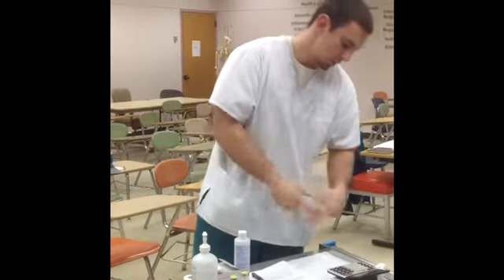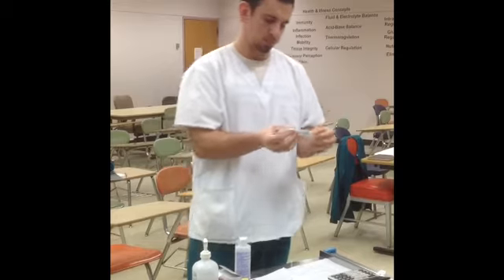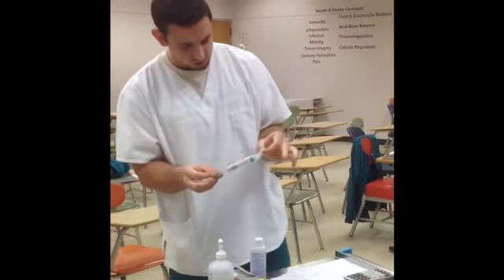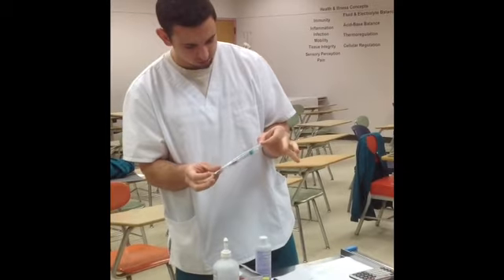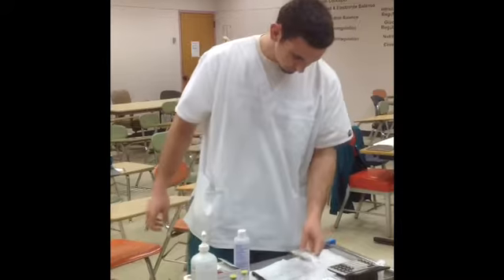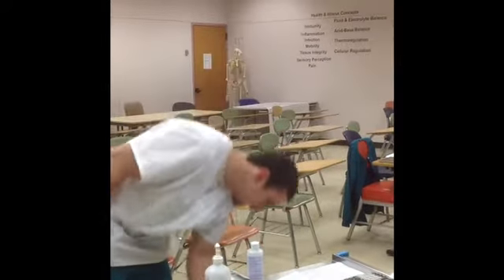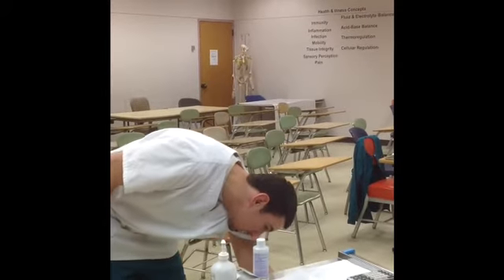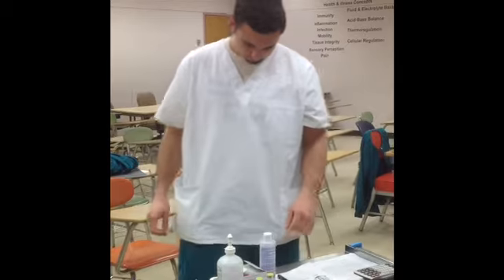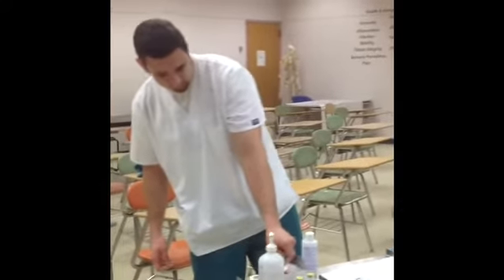Usually it's just the 2x2 gauze. Look for the right needle, so I'm looking for a 3 ml syringe. I'm looking for a 23 gauge. So that's what I got right here, alright? Perfect, just what I need. And I'm also looking for some gloves for later. Alrighty, and I'm going to look for the alcohol prep pads, the isopropyl alcohol, 70%.